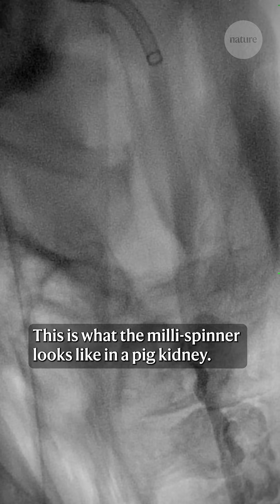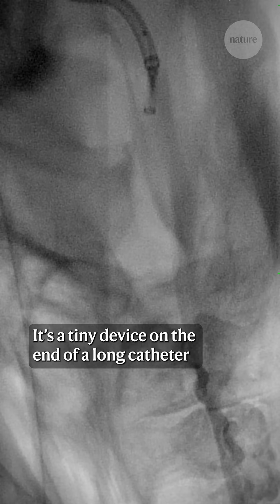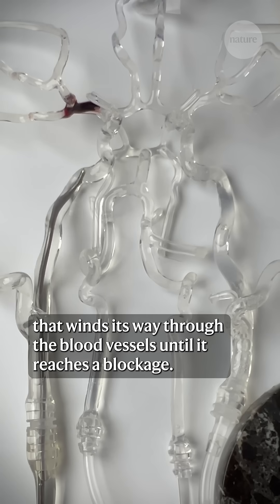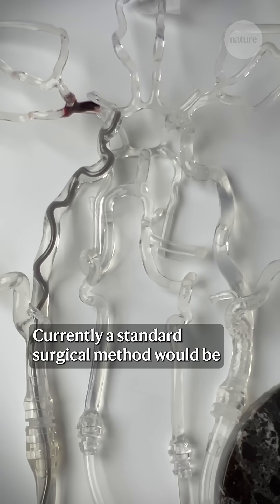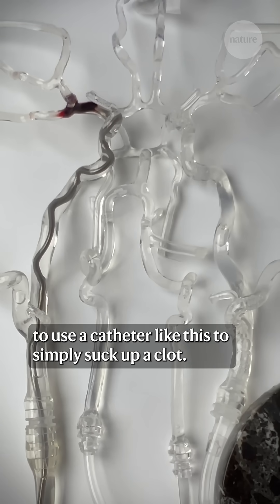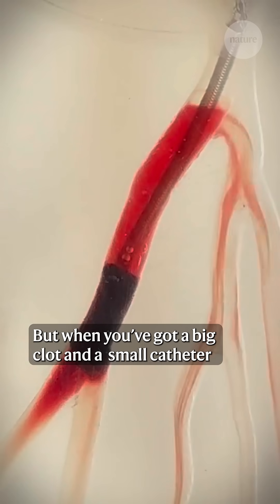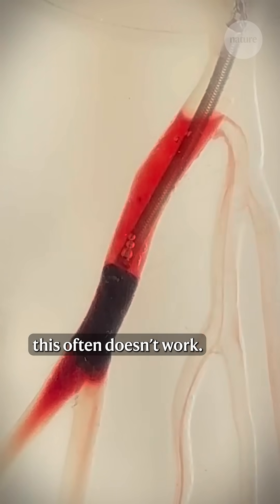This is what the millispinner looks like in a pig kidney. It's a tiny device on the end of a long catheter that winds its way through the blood vessels until it reaches a blockage. Currently a standard surgical method would be to use a catheter like this to simply suck up a clot, but when you've got a big clot and a small catheter this often doesn't work.